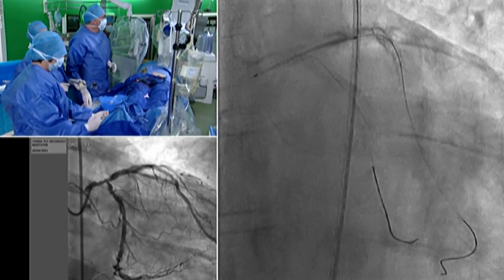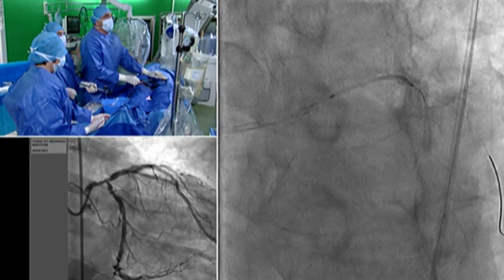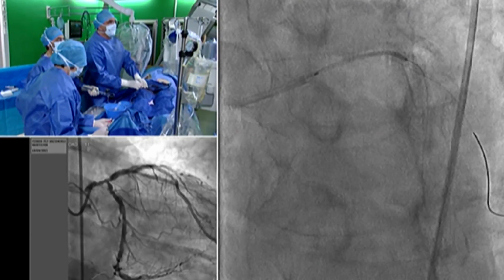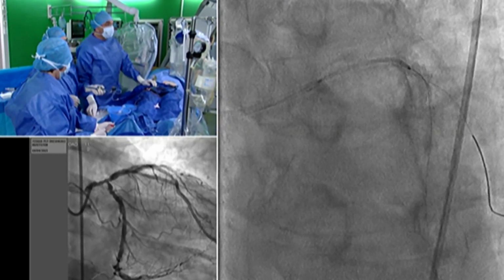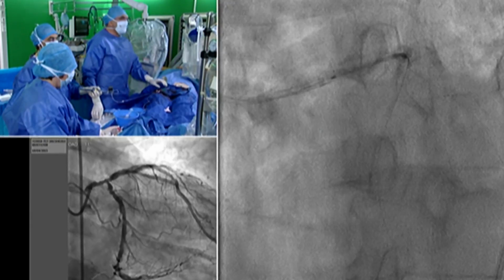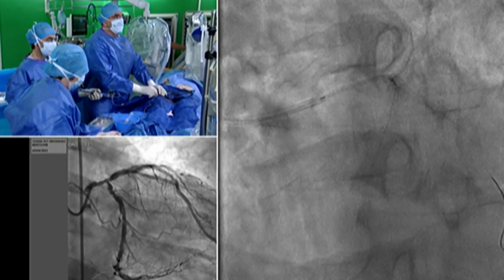We go to the LAO-cranio and try to verify if we cover the ostium correctly. We are working with 6 French femoral access because the radial artery was closed. It's a left femoral because he also has severe distal disease, particularly on the right iliac artery. So it's a 6 French catheter.